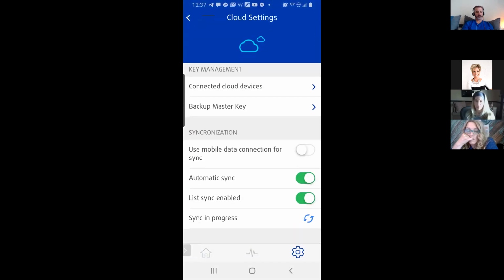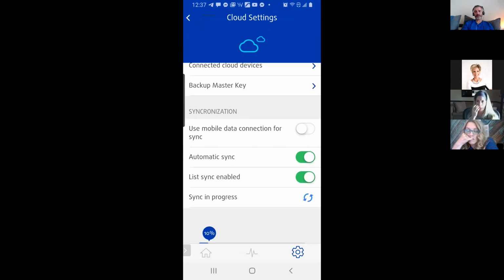So, backing up the master key, use mobile data for sync. Here's the thing: if you're not connecting your device all the time to Wi-Fi, and you have this off, then you go to reboot your Healy or restart it, and you're like, wait, I unloaded and reloaded the program, and I can't find my client information anymore. Where is it? Well, you were never syncing it to the cloud. So it was only on your device. It never got put on the cloud. So it's gone, okay?